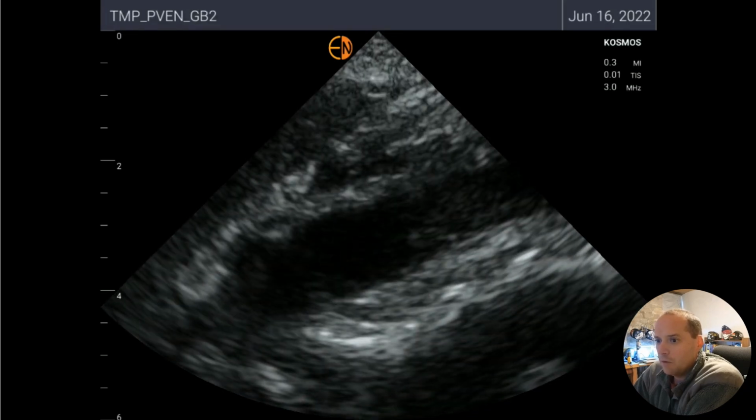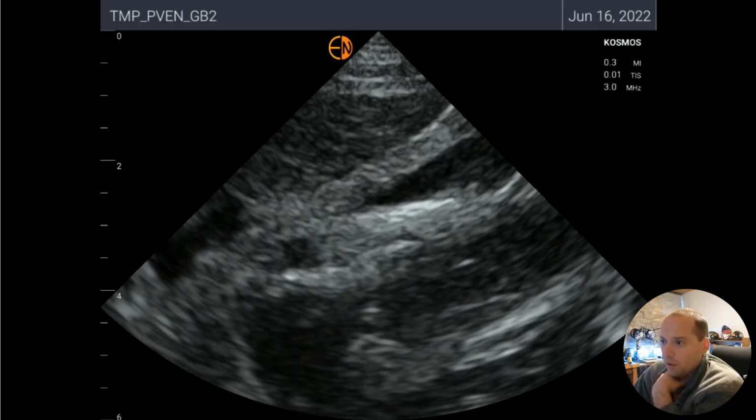So I'll go back to that view. Here's our actual aorta, and you notice the stomach's right here. So she's actually a grade 0, an empty stomach. What this was is actually her colon moving stool.